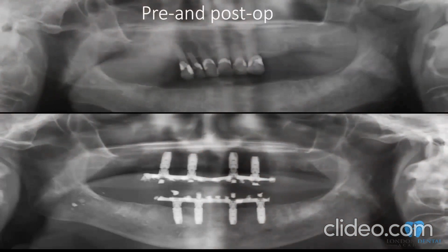And again, the post-op, as you can see, 4 implants straight, all in place in situ, and this is the post-op.